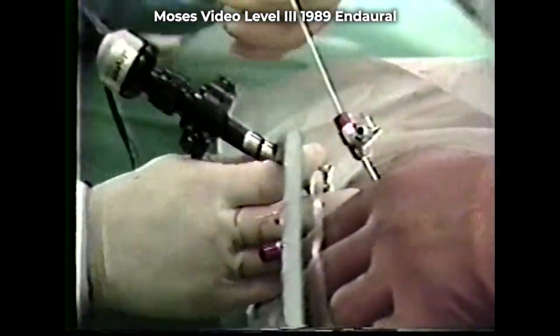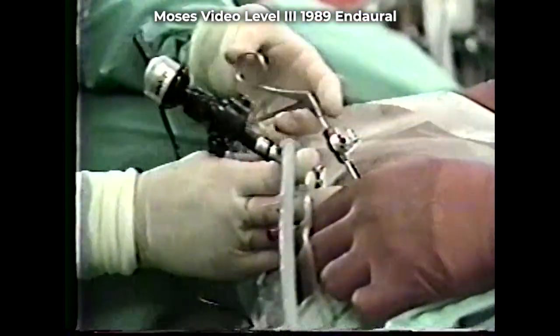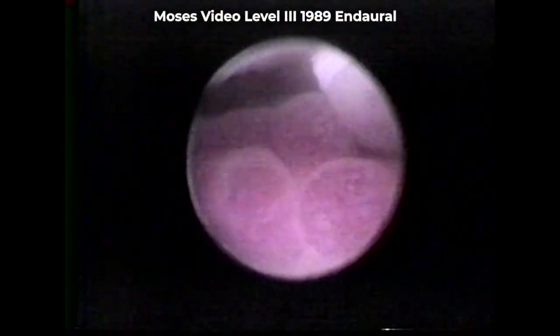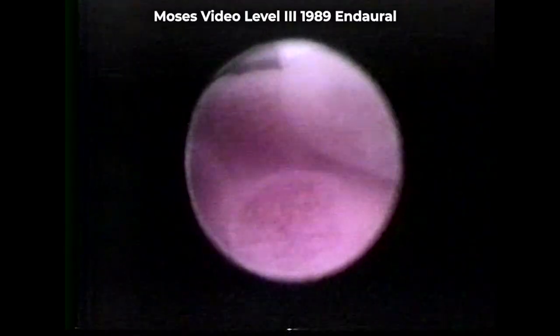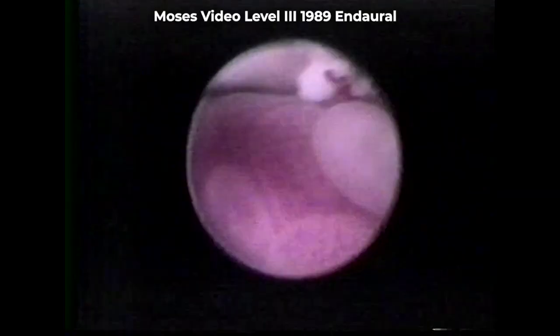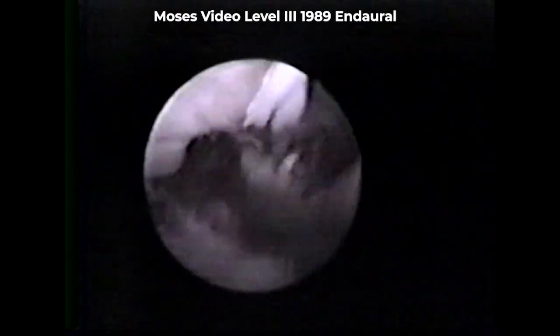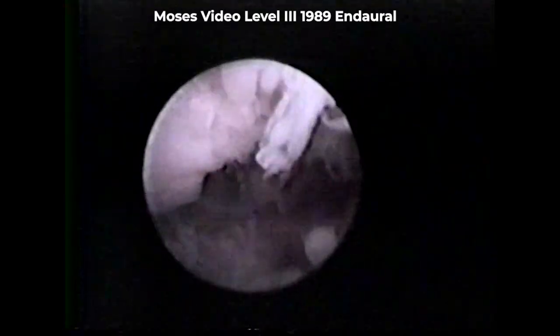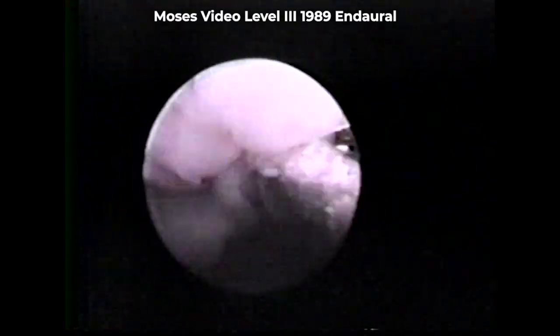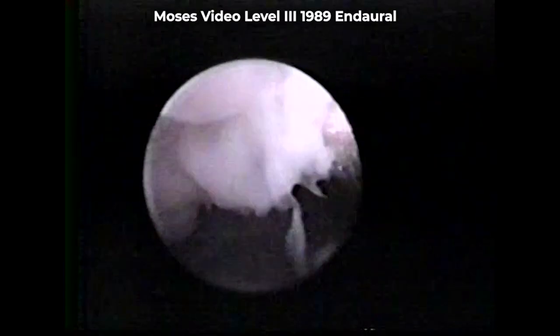In this case, a small cup forceps is introduced to remove synovial adhesions and granulation tissue. Here we can see the reactive granulomatous tissue in a previously operated joint with reactive and proliferative synovitis. The cupped basket forceps can be seen removing tissues from this superior joint compartment for debridement and histopathologic examination.